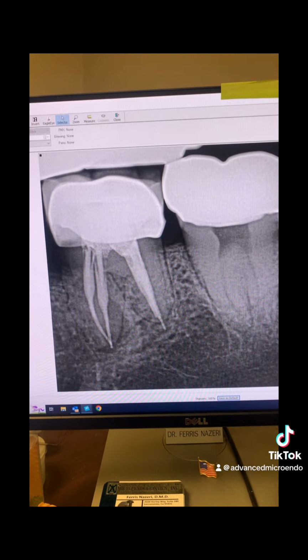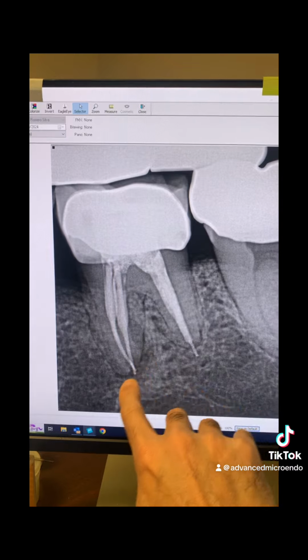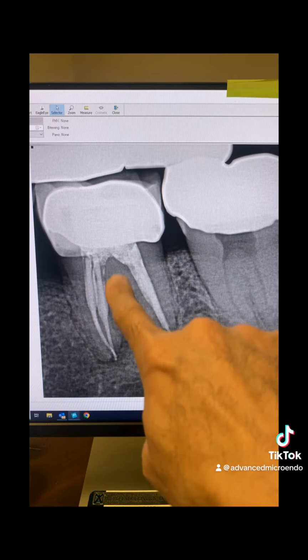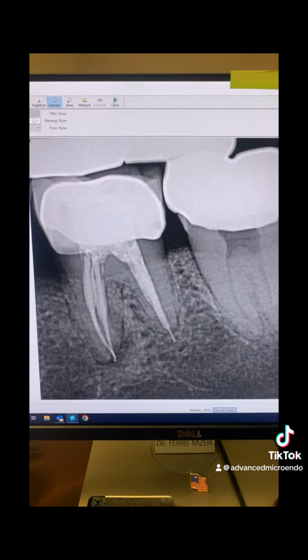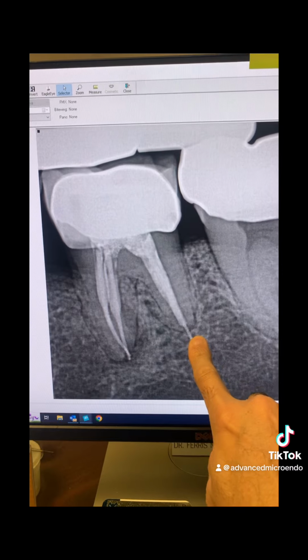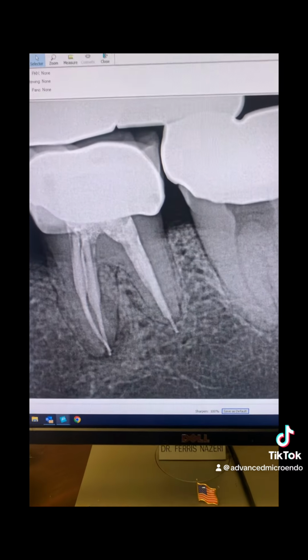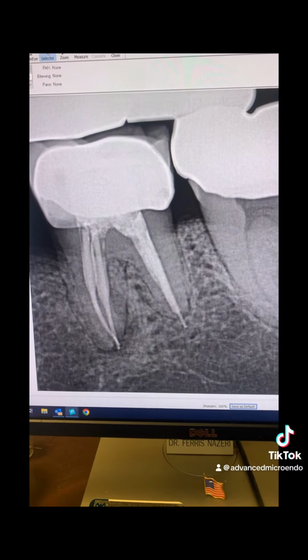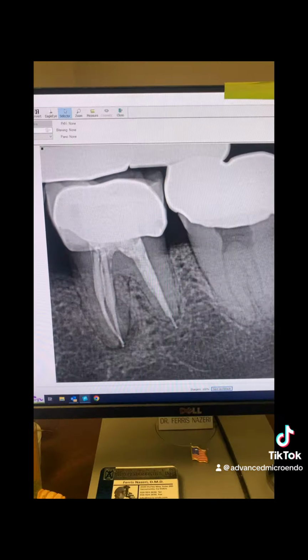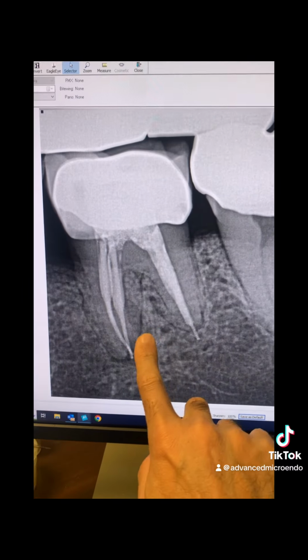chewing and to biting. If you look at multiple angulation PAs, you can see the periapical lucency here associated with tooth number 19. So take a look here. Coke bottle preparation, right? Periapical lucency here. Look at the distal. Look how long the gutta-percha is there. Okay, so overextended gutta-percha, no periapical lucencies. All right, so no periapical lucency there. Periapical lucency here.